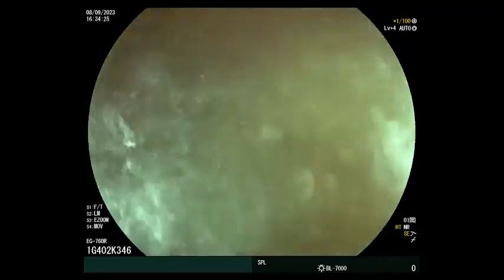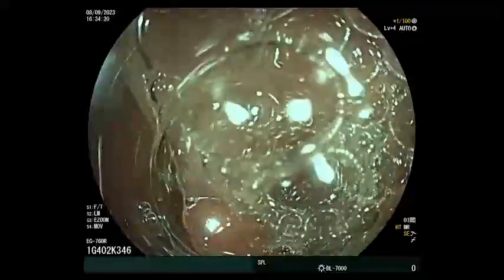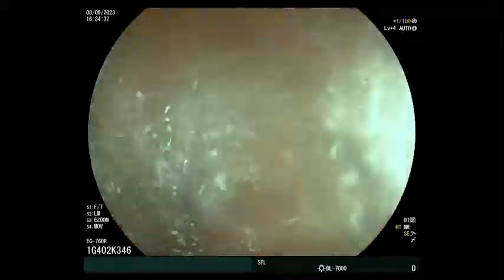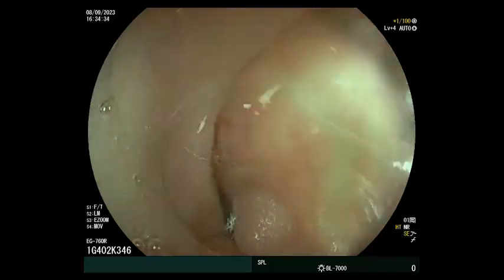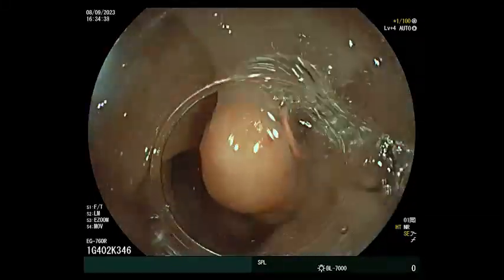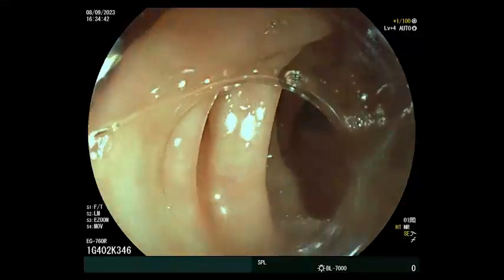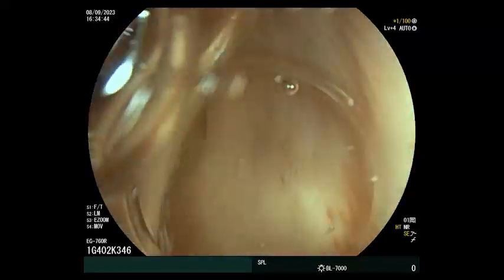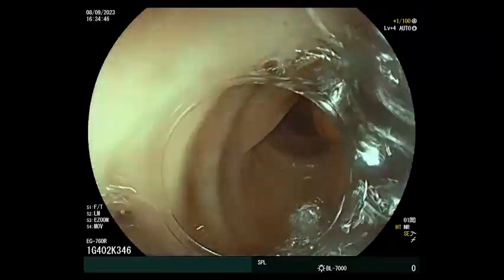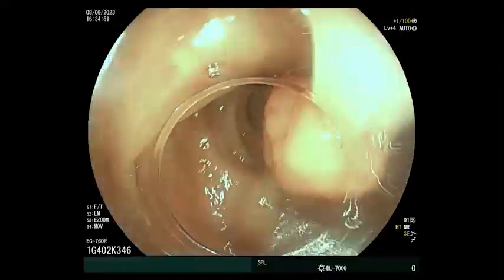So what do you think, Mohammed? Which method to resect? I think that what we are doing now is a very important step, how to assess the lesion. Because you need to clean the colon thoroughly. We are not worried about the perforation itself, but we worry about the peritonitis or fecal peritonitis. So the first and most important thing is that we have to clean it thoroughly.